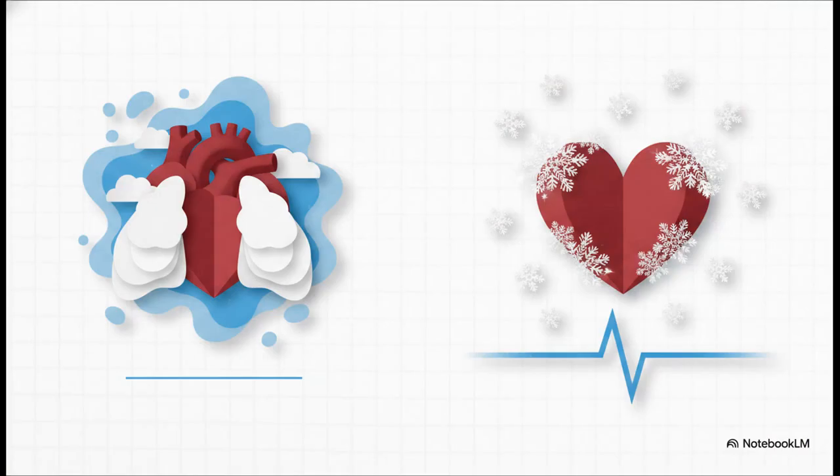Plus, if you're seeing generally muffled, globally low voltages everywhere, it's a huge hint that something physical is dampening the signal between the heart and the skin. We're talking fluid, the hyperinflated lungs of emphysema, or even severe obesity. And what about the environment? Freezing temperatures from hypothermia cause a really slow heart rate and produce these very distinctive tiny little notches at the end of the QRS complex. We call those Osborn waves.